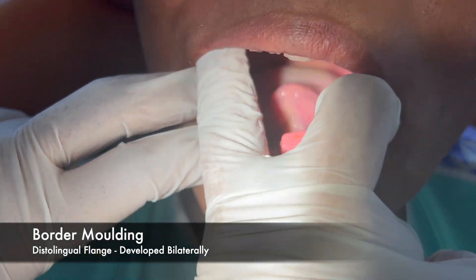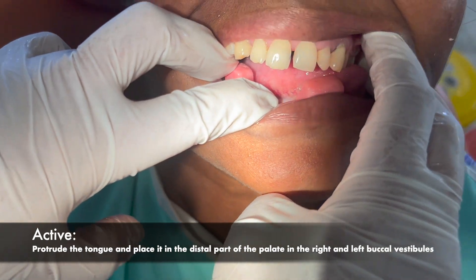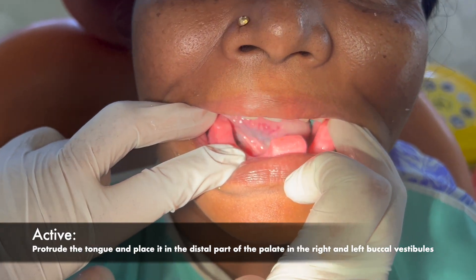The distolingual flange is developed bilaterally. The patient is asked to protrude the tongue and then place it in the distal part of the palate, in the right and the left buccal vestibule.